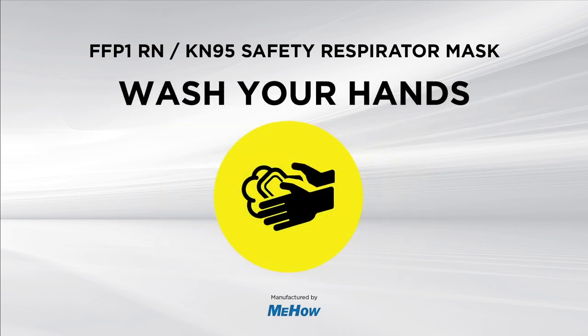Now that everything has been cleaned and sterilized, please wash your hands in accordance with recommended guidelines before reassembling the face mask.